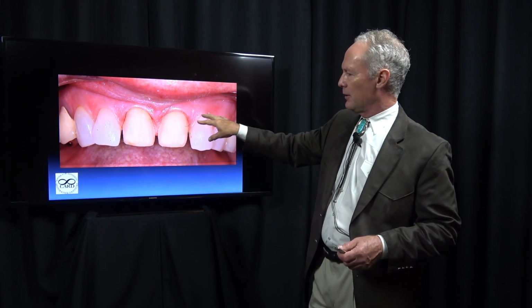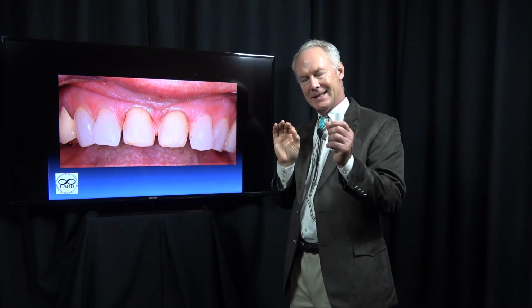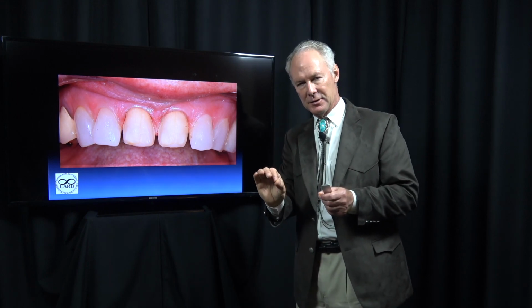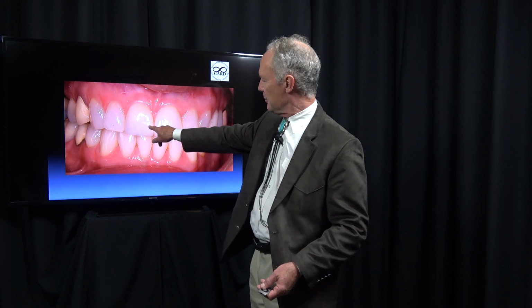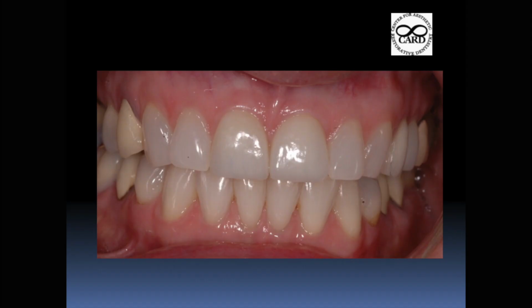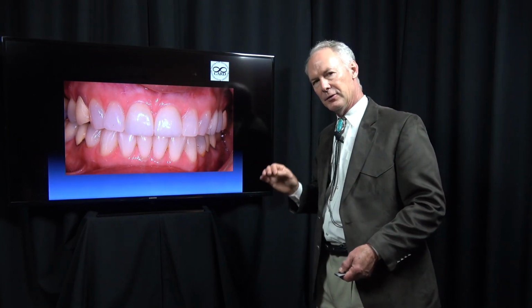The shade was very good with the veneers alone, but I might want to influence it just a tiny little bit with a little lighter cement. So this is my final selection, which is transparent or translucent. And here we have it, the cemented veneers, and you can see we have a very nice, harmonious shade match. And you can do this every time if you'll use this method.